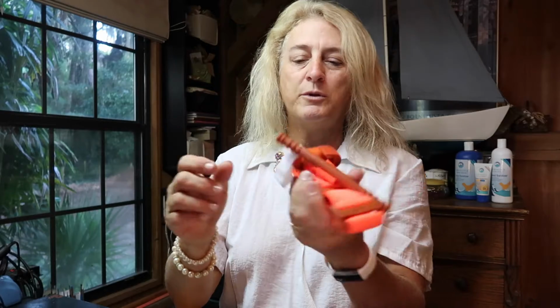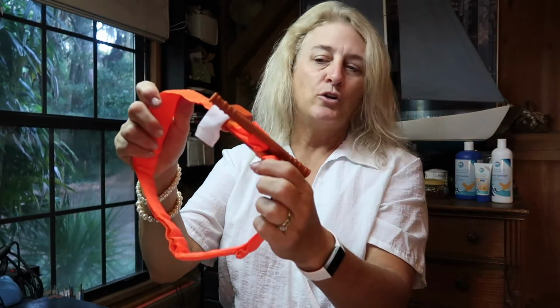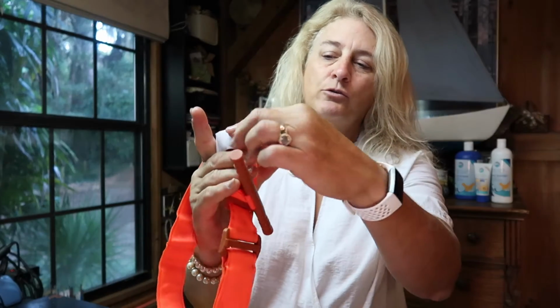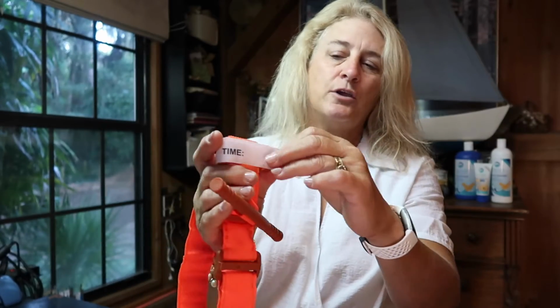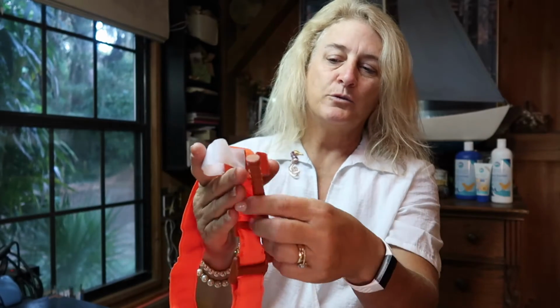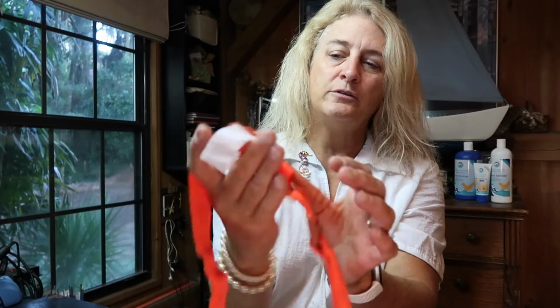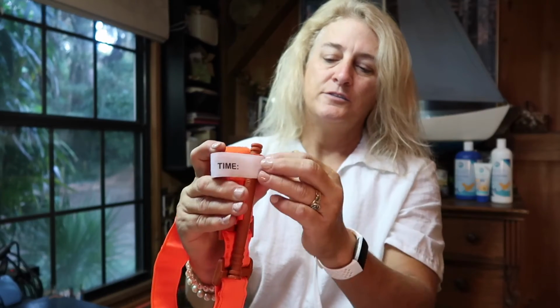This is a North American Rescue tourniquet. It's in the ready stage. I've got it set for somewhere between an arm and a leg so that I can go either way. It has a Velcro bit that goes over the cradle right there that you could put the time that you applied it on. This is the windlass. You would twist and then sink the windlass into the cradle like that, and then secure it.